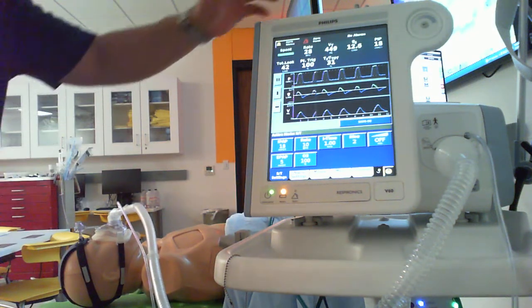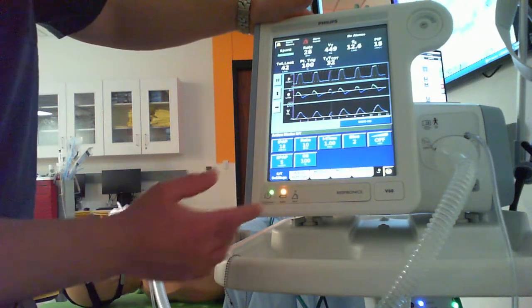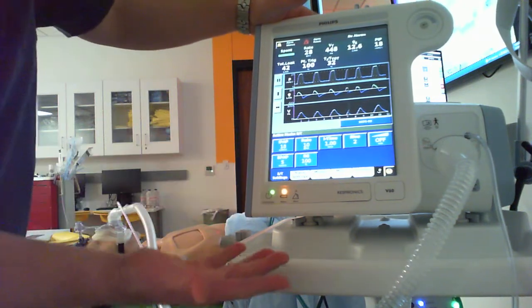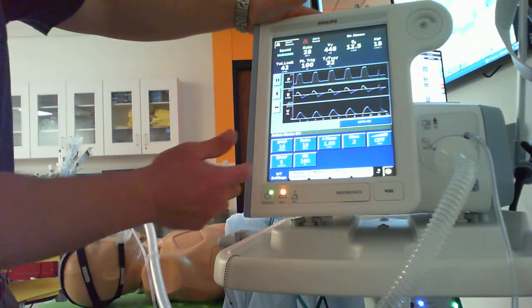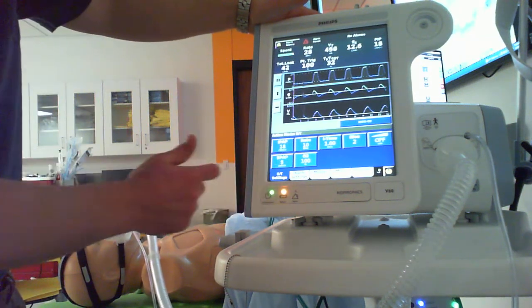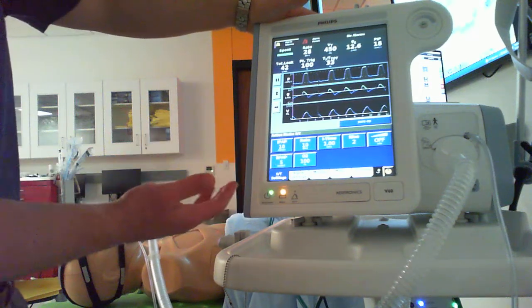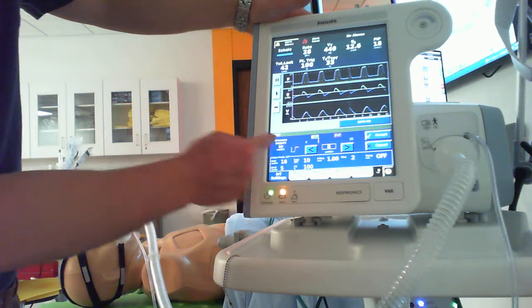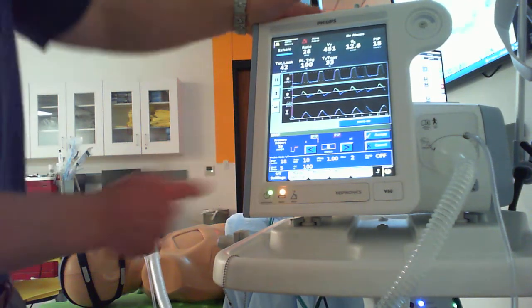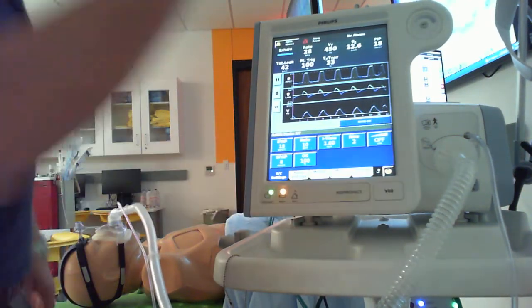So let's say on this patient, I wanted to go up because I'm not reaching my oxygen goal. I can't wean them off 100%. I get an x-ray and, pulmonary edema and things like that. Let's say I wanted to go up on my baseline pressure. And he's treated like a CHF type patient or something. Let's go up to 8 centimeters of water. Look what happened to my pressure support. It went down to 10. Well, what's going to happen? I hit accept.